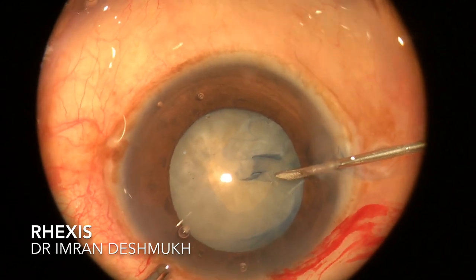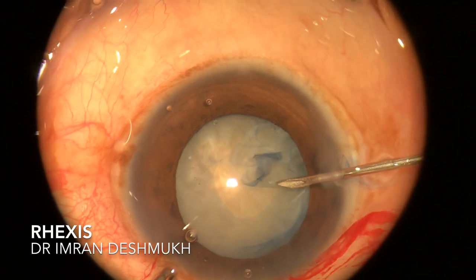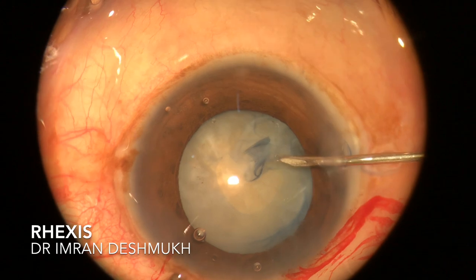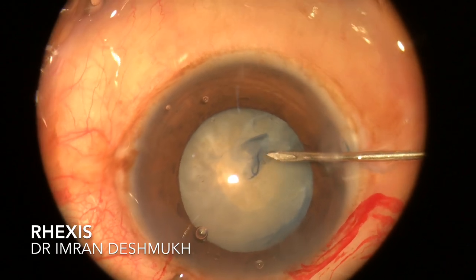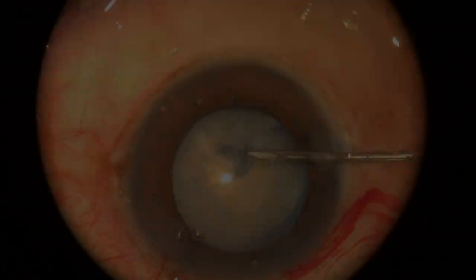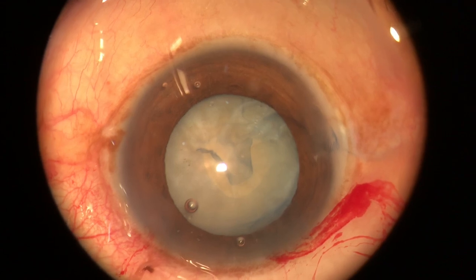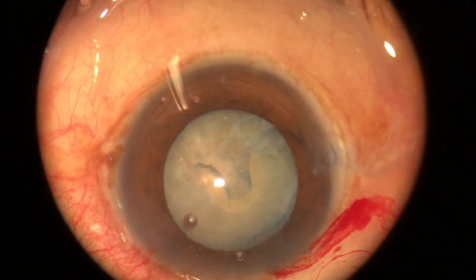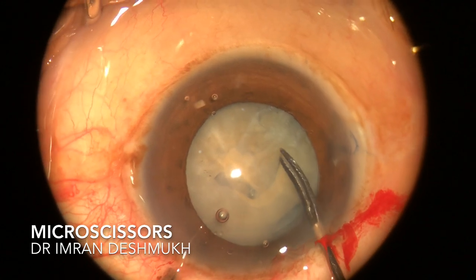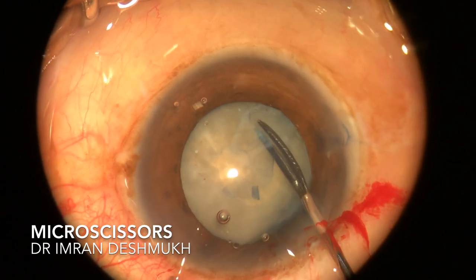At this point I had to struggle because the capsule was very much calcified and I could not extend my rhexis further. I tried extending it with my cystitome but had a really hard time. I slowly took out my cystitome, inserted some visco, and after inserting visco I took my micro scissors, entered through the main port, and started cutting the calcified capsule.